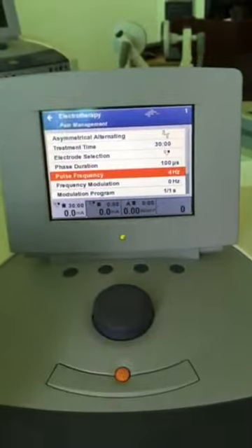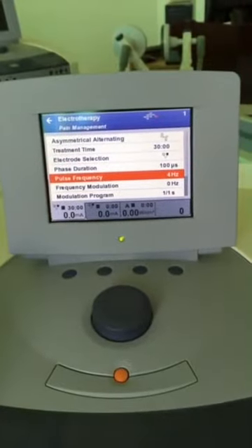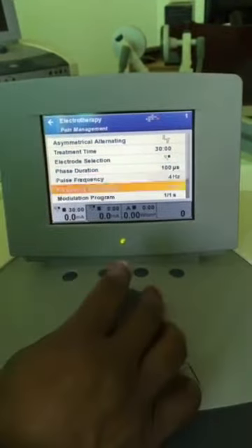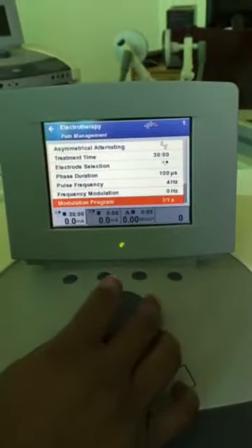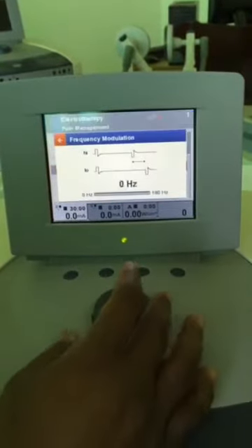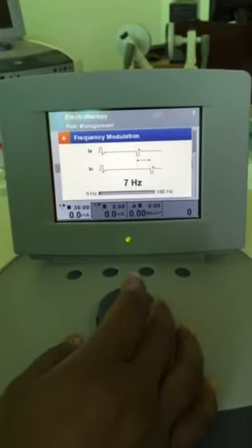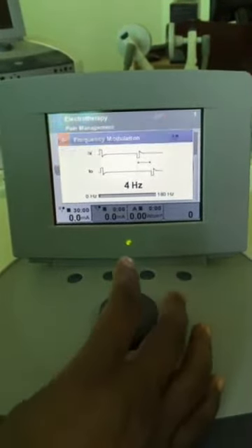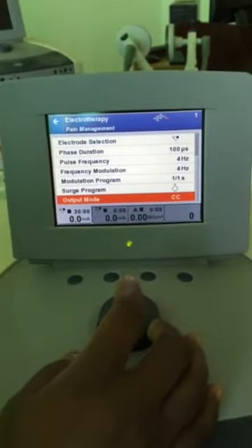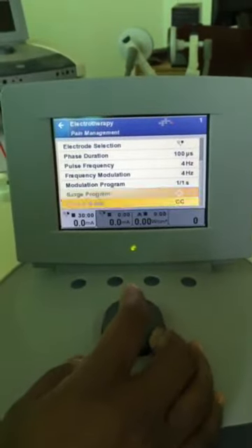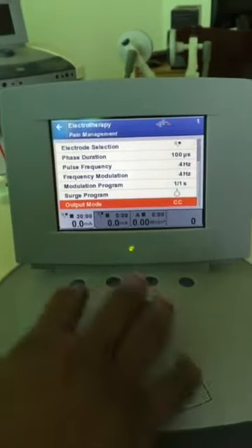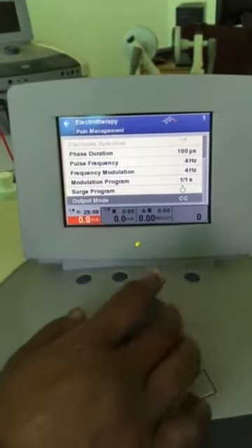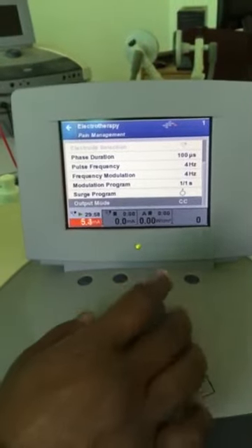I have kept the frequency at 4 Hz for chronic pain. With frequency modulation set at 4 Hz, the frequency will be changing. Now start and apply the current.